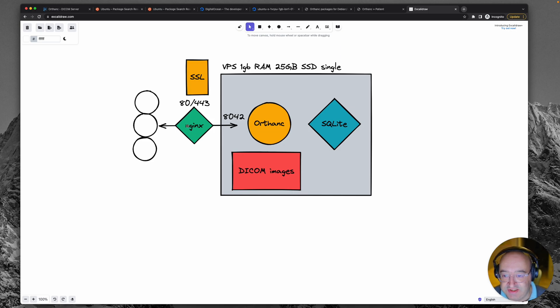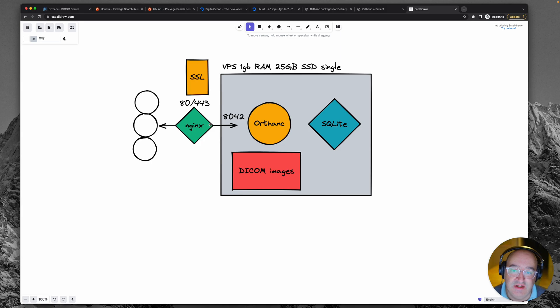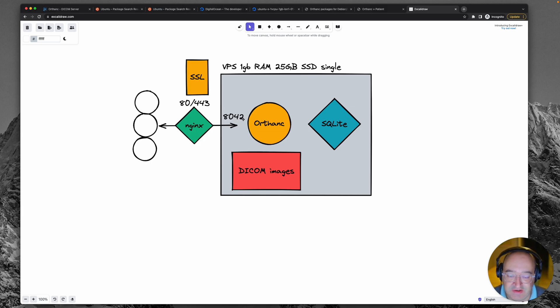So Nginx is going to receive the requests. It's much better at handling lots of requests. And then it is going to proxy the request to port 8042 on the server to communicate to Orthanc.